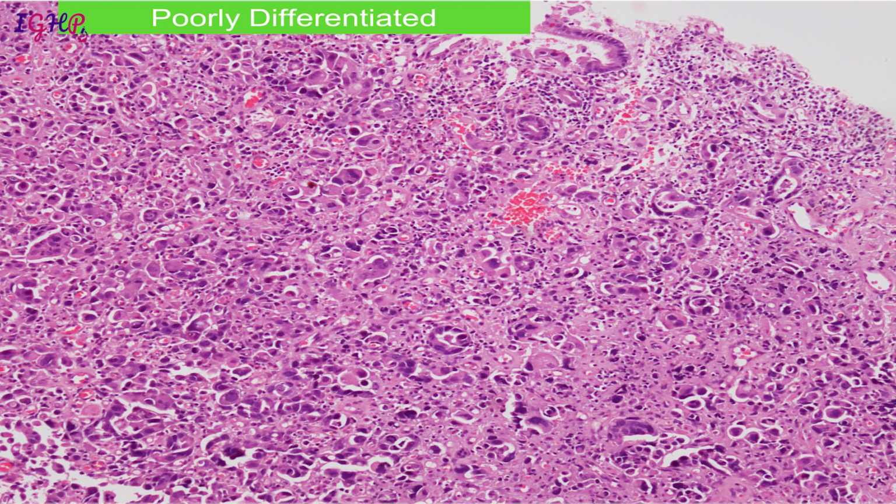if you are not able to ascertain from the cell shape or from the cell nuclei what category it belongs to, whether it belongs to an epithelial, mesenchymal, lymphoid, or a melanoma. In those cases, it is better to call them a poorly differentiated malignant neoplasm, and then you can advise IHC for further categorization. But if you find these vacuoles, you find mucin somewhere, then in those cases you can still call them a poorly differentiated carcinoma, but in those cases also you will advise IHC for confirmation.